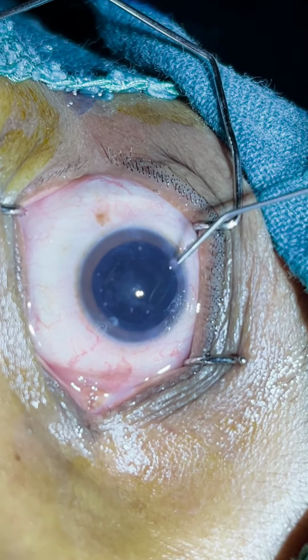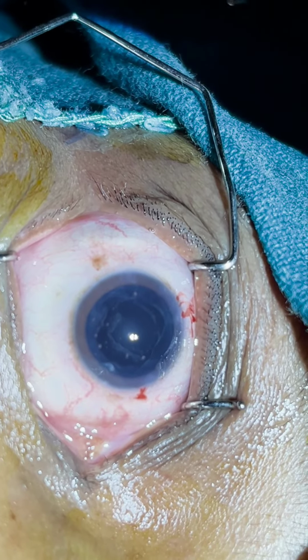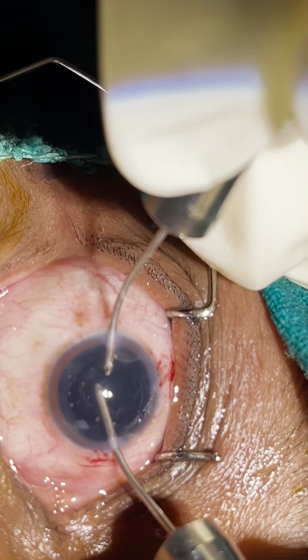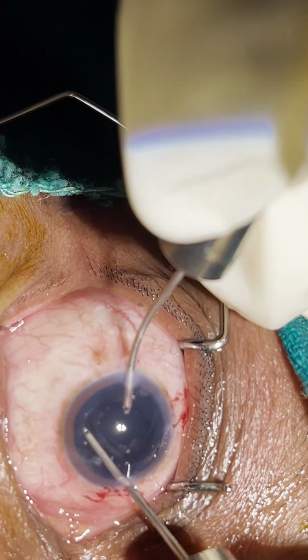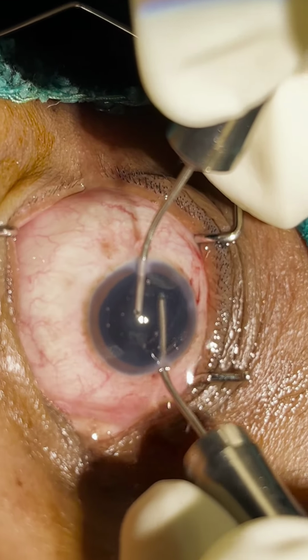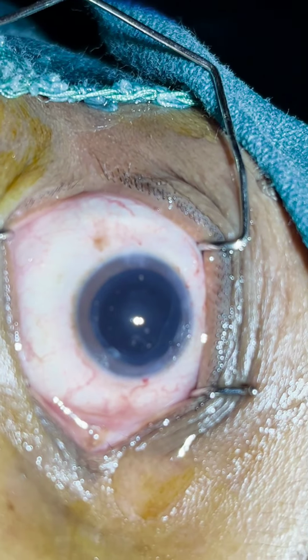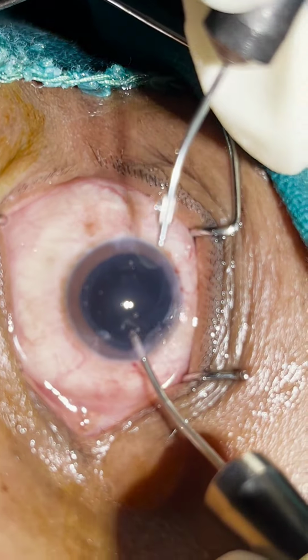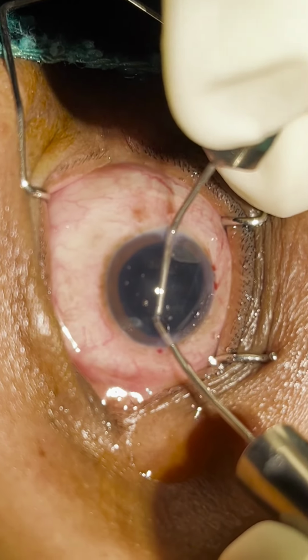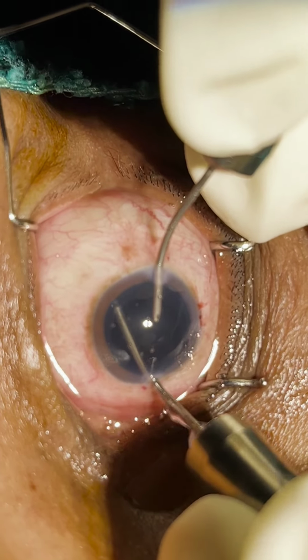Now we'll go with bimanual irrigation and aspiration to aspirate the cortex. Now with bimanual irrigation and aspiration, we'll aspirate out the cortical matter. Almost we are done with the cortical matter wash.